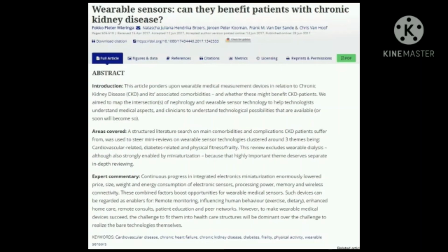Fifth, it should be user-friendly and hassle-free. Most CKD patients are old and many have diabetes with numb fingertips from blood sample needles and or impaired eyesight. Also, rheumatism, tremors, impaired vision, and low hand strength raise the bar when designing wearables. For this patient group, great attention is needed for easy battery charge or exchange, and for battery life maximization. Screens should be well readable and controls should be intuitive and feel good.